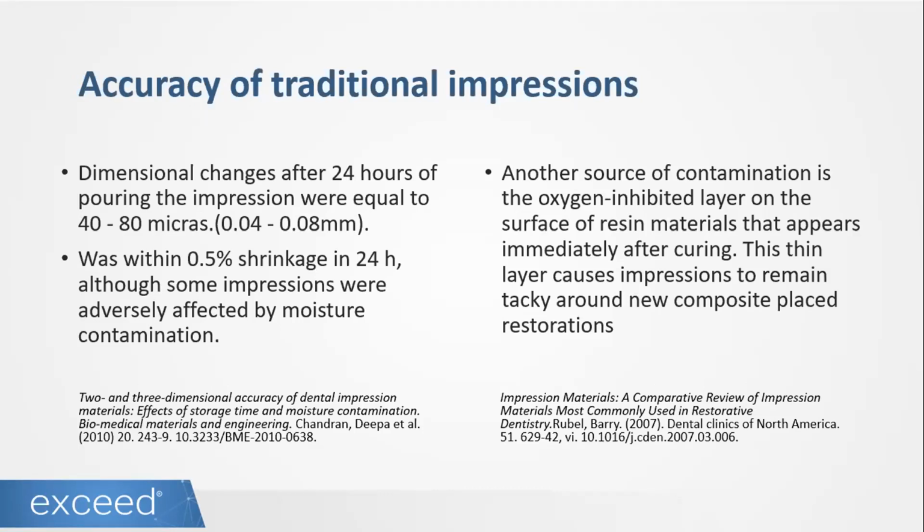And if we use traditional impressions, we should use materials that maybe are a little bit more hydrophilic, because we know the PVS is hydrophobic. There are now some PVS that are more hydrophilic. And here you can choose the brand that you want. For me, Aquaseal works really well. But here it is always important to remember that scanners are going to have a little bit of distortion, a little bit of inaccuracy. And PVS impressions also are going to shrink a little bit.